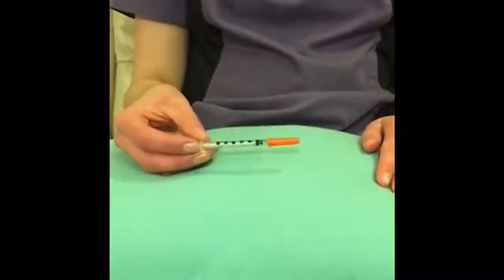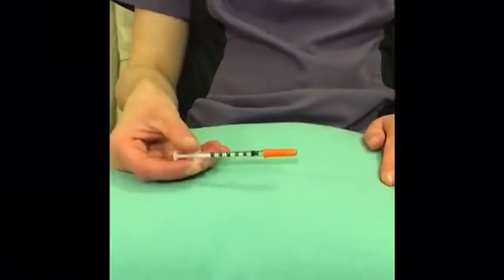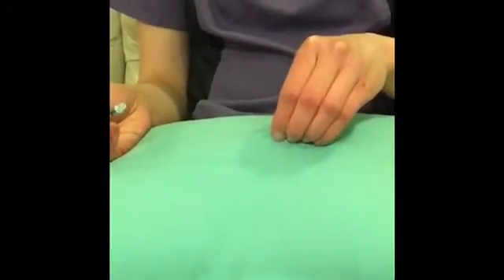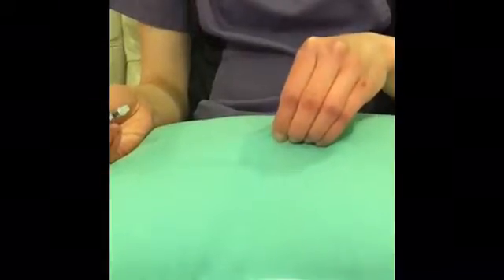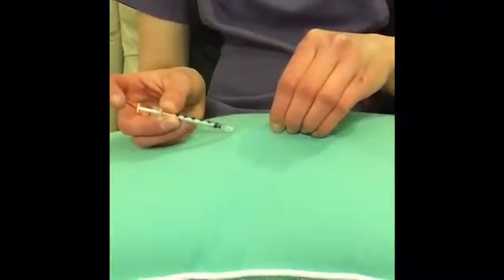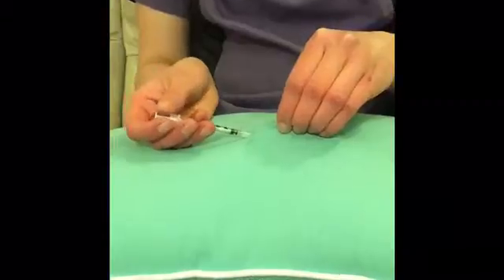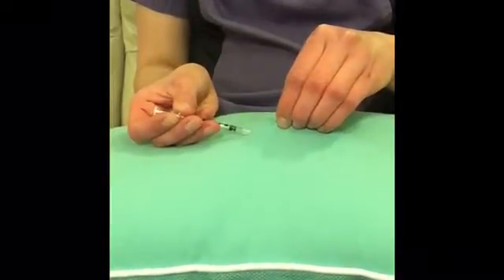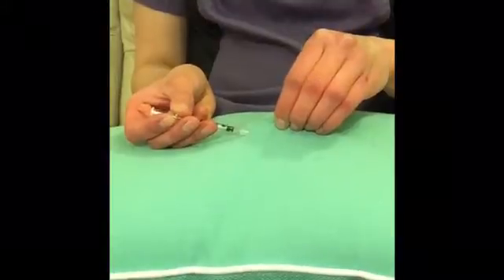Here we have Seti's insulin syringe all ready to go with the amount of insulin he requires drawn up. You're going to remove the cap off of the needle, and imagining this is your pet's back, you are going to pinch the skin and make a tent. The easiest place to do this is in between the shoulder blades or over the back of the neck, as these areas have the most skin. Once you've made your tent, quickly insert the needle into the hollow part of the tent. Then draw back on the plunger to make sure you're not in a blood vessel — if you see any blood come into your syringe, do not inject; simply come out and start again.